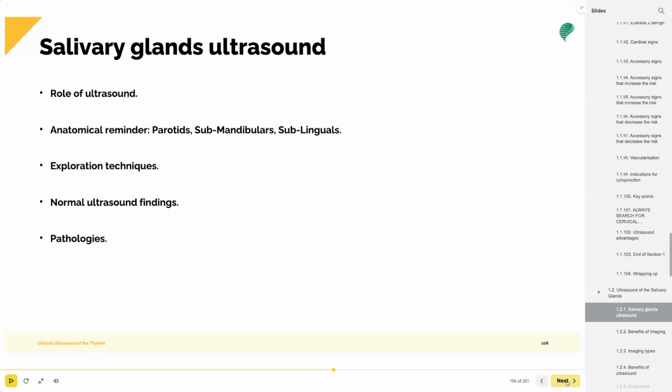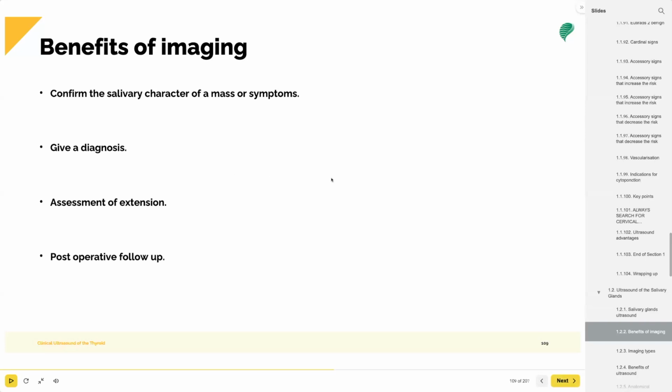It plays a role in determining issues in the neck along with the thyroid. We will use conventional tools such as ultrasound, and if the doctor would like, if there's something that warrants it, they would do further exploration with CT or CAT scan.